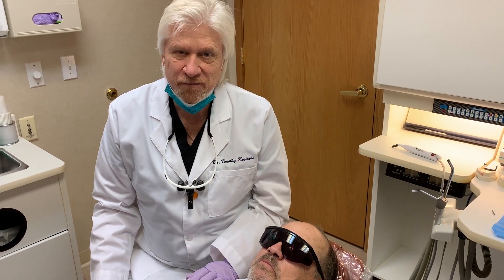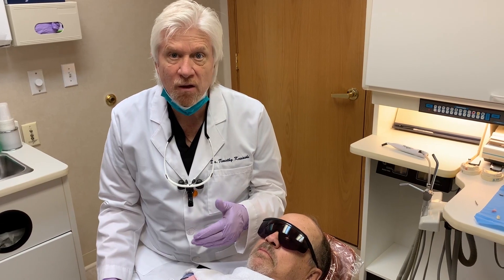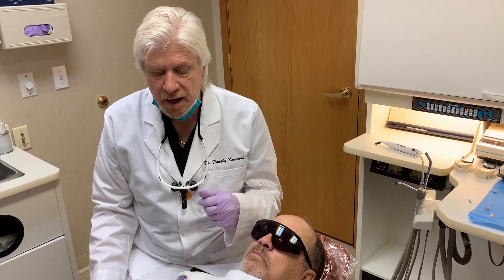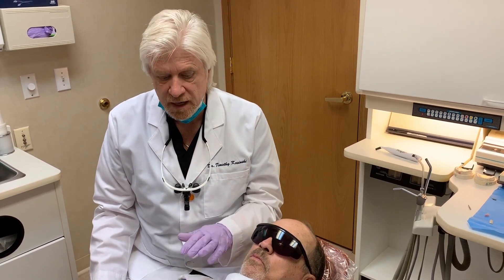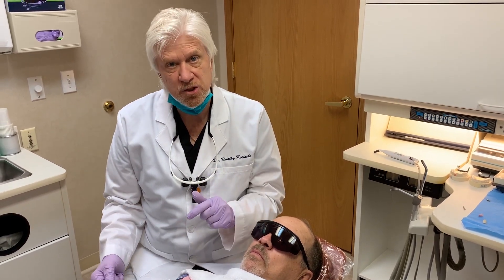Hi, I'm Dr. Tim Kosinski from Bingham Farms, Michigan, and I was asked to demonstrate a new technique that's very helpful in our practice — the use of the Penguin RFA torque determining device to help determine implant stability with objective measurements.